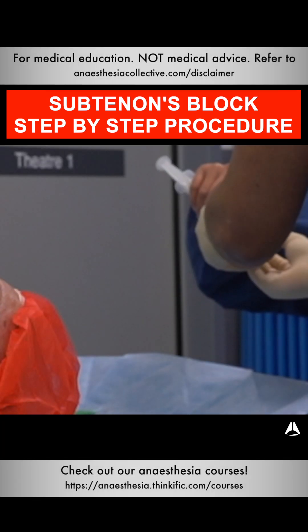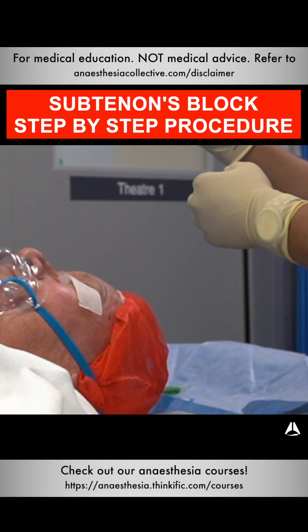I use three to four mils of my solution — 2% lignocaine with 30 units per mil hyaluronidase.